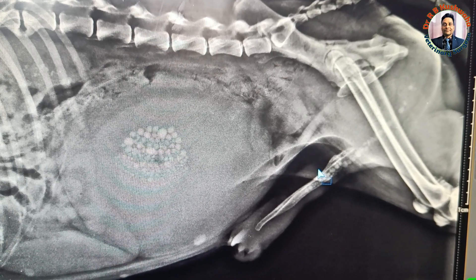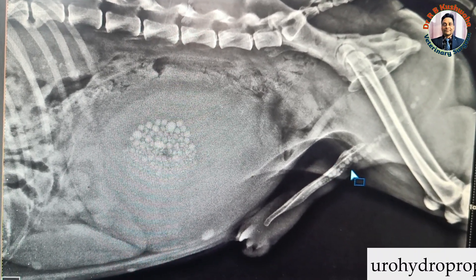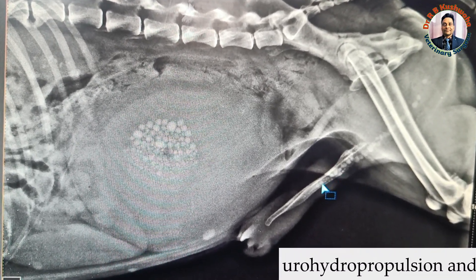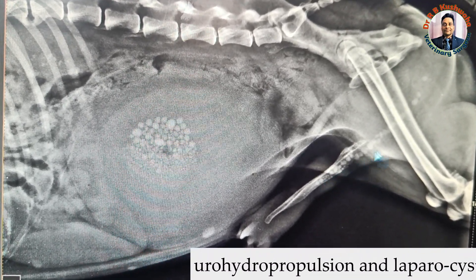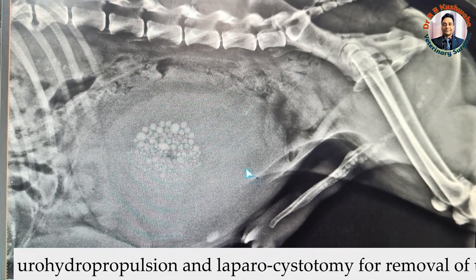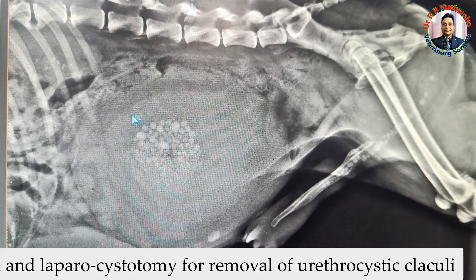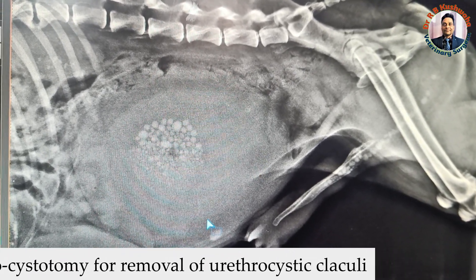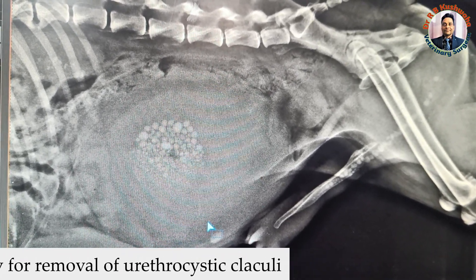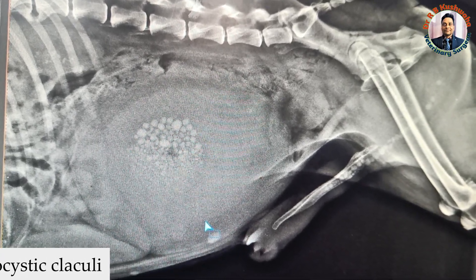We managed this case by urohydropropulsion of the urethral calculi back into the urinary bladder, and from the urinary bladder we removed the entire calculi after performing a laparocystotomy.